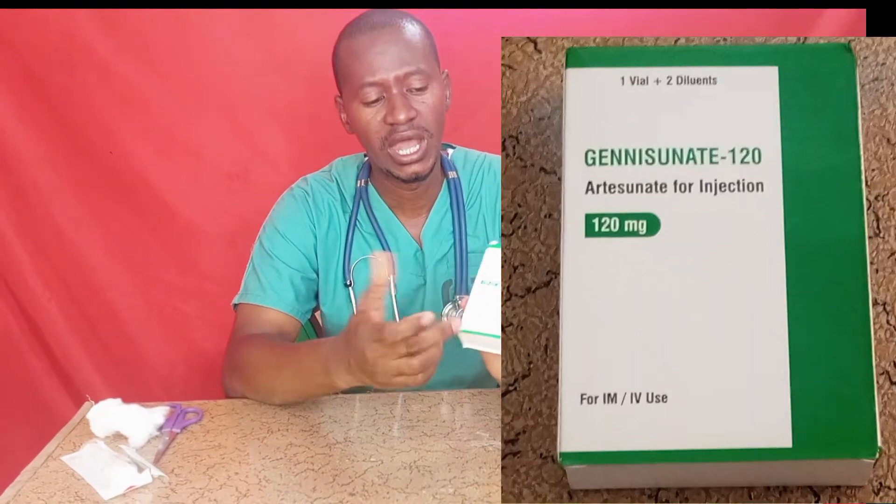Hi everyone, welcome back. In today's tutorial we shall be discussing how to prepare and use IV or IM artesunate for injection to treat severe malaria patients.